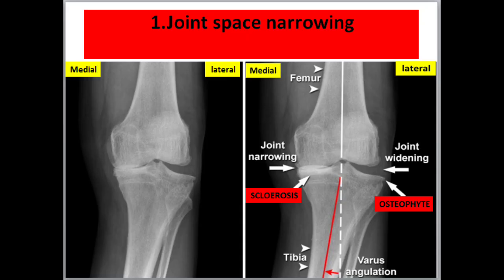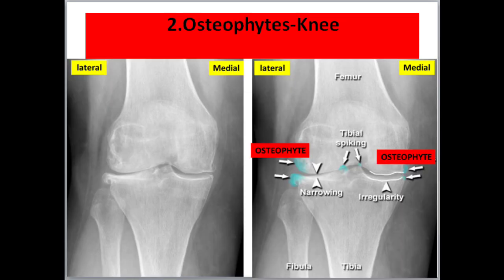Number one: joint space narrowing. In this picture, we see the medial side of the knee joint is severely narrowed such that the femur and tibia are touching, and the lateral side of the joint is widened. There is abnormal varus angulation of the tibia. We also see increased density indicating articular surface sclerosis.